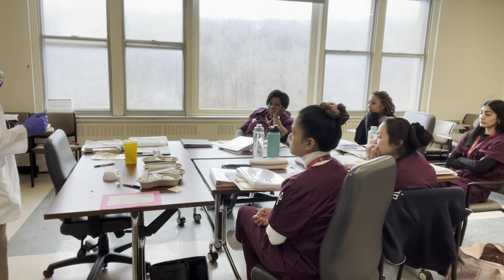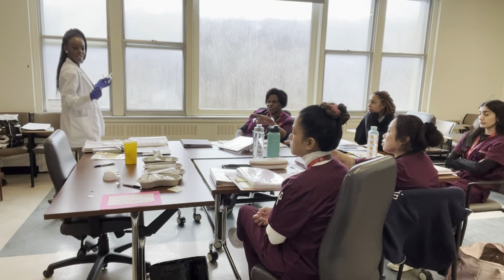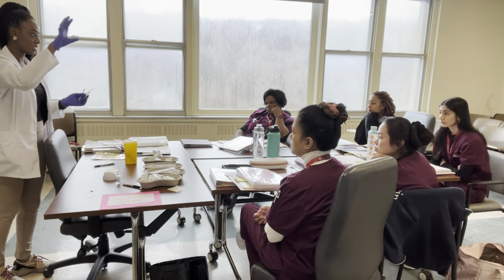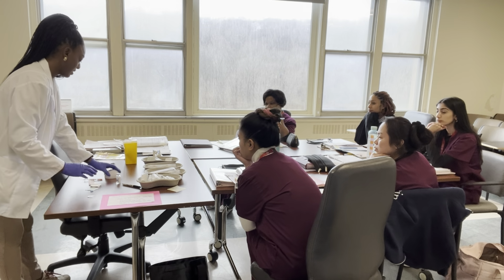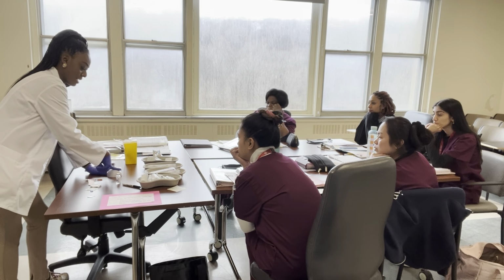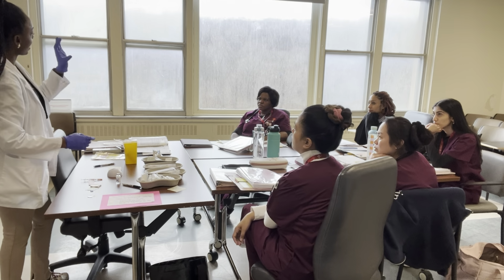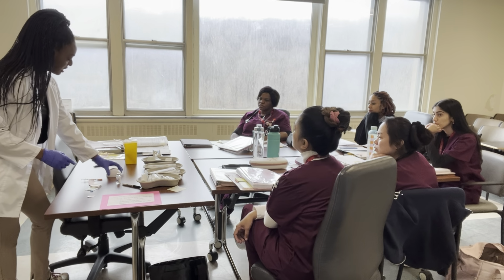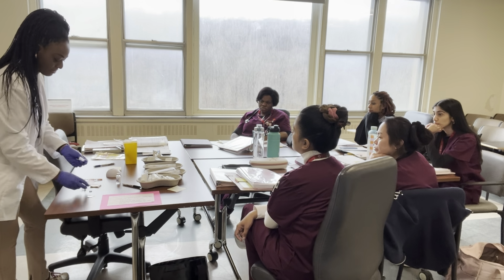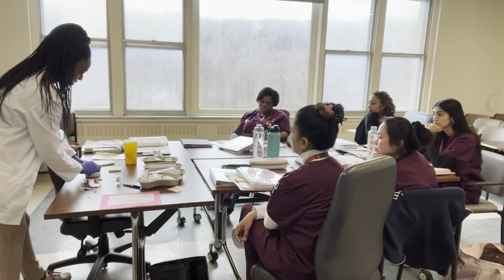So always gloves when you enter the room with your supplies. Good? And then when you enter, what else do you look for in the room? Oh, okay, the sharps container has to be somewhere visible. Sometimes it's on the wall, sometimes it's on the table, you need to find it. Then you make sure that you expose the area. Again, 90 degrees when you're grasping more than an inch of fat between your fingers, 45 degrees if it's less. Then you clean the skin. I'm going to go here and angle. I don't know if you all can see.